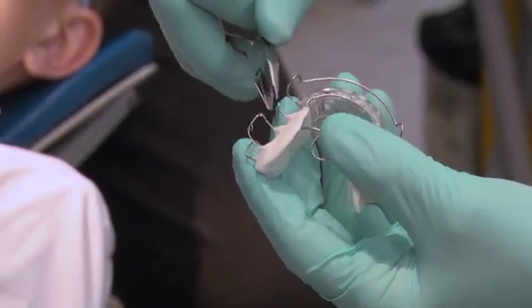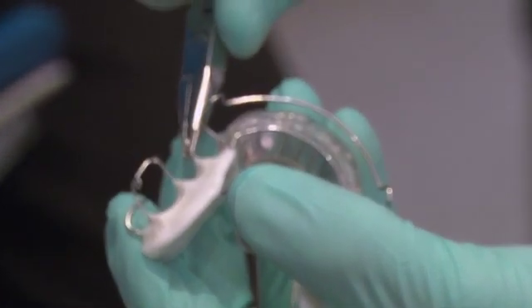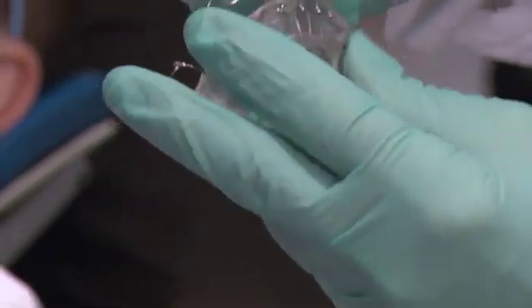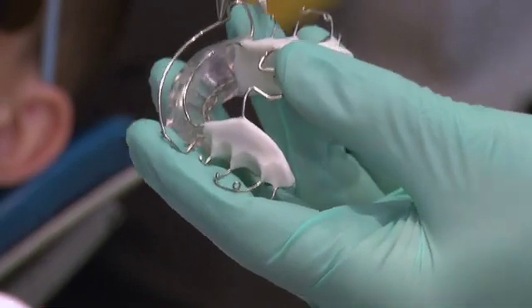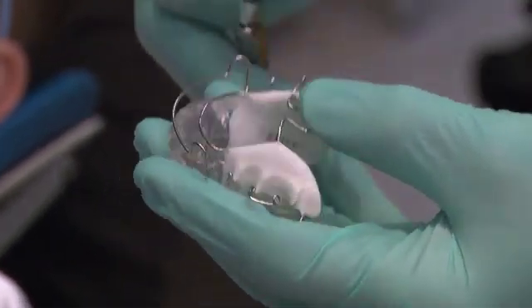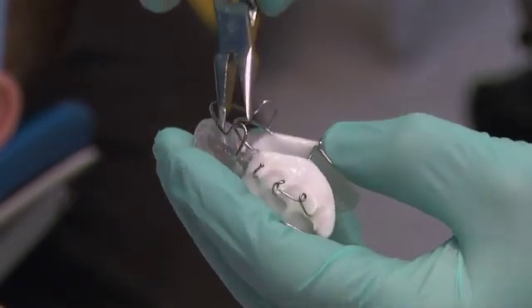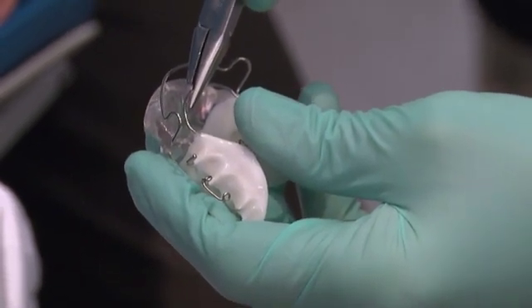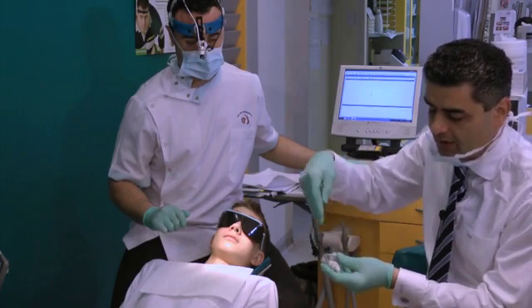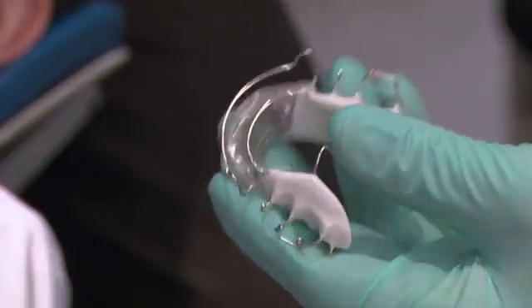Ball clasp activation is the same story — it can be right up at the ball, or more likely where the clasp enters the embrasure of the tooth, and we activate it to make it more retentive. For the labial bow, if I want to de-torque incisors, I grab the loop and press this way. If there's too much torque — where losing torque is becoming a little bit division 2 — I'll press and open the loop, and activate the inner bow by pushing forward. We activate the inner bow and release the outer bow because we are de-torquing the incisors. Oliver is wearing this appliance so well that the upper incisors are becoming a little bit division 2. If it was the opposite with proclined incisors, I would release here and activate there.